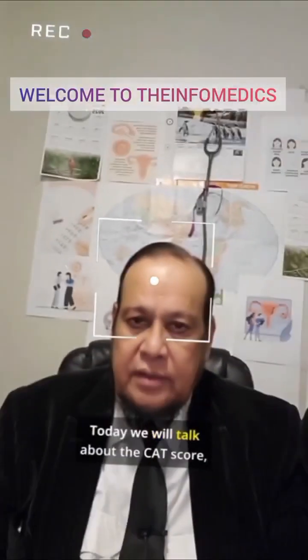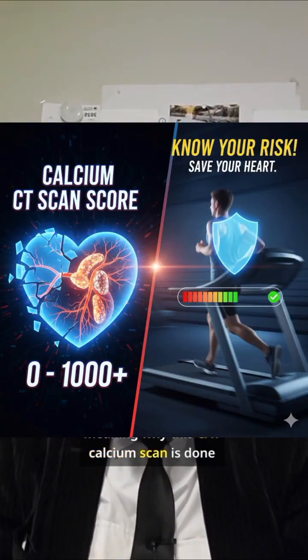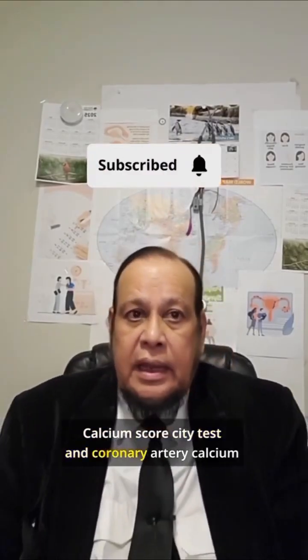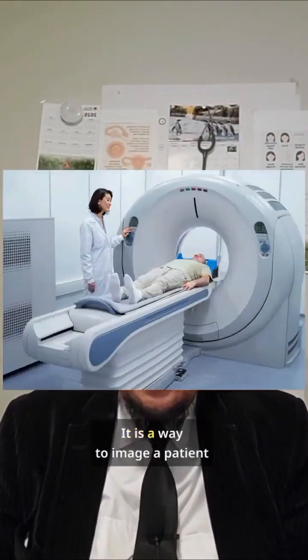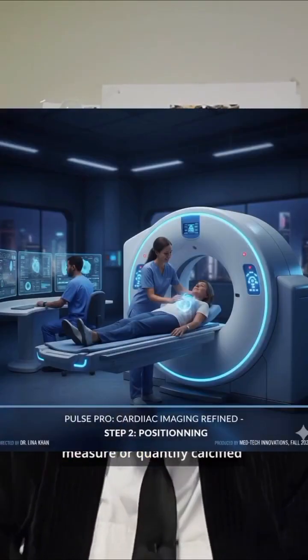Today we will talk about the calcium CT score, that is, why it is called a calcium CT scan and what it actually is. The calcium score CT test, or CAC, coronary artery calcium CT scan, which is commonly referred to as the calcium CT score test, is a painless imaging method performed without any discomfort to the patient, which examines the coronary arteries or vessels of the heart.